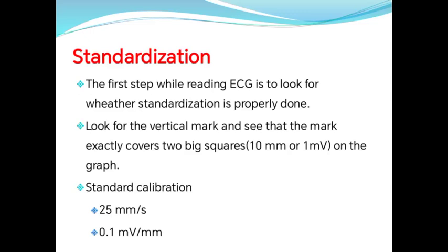Then we should know this. We took the ECG paper. We should look that it is well standardized and calibrated, that the velocity is 25 millimeters per second and the caliber is 0.1 millivolt per millimeter.